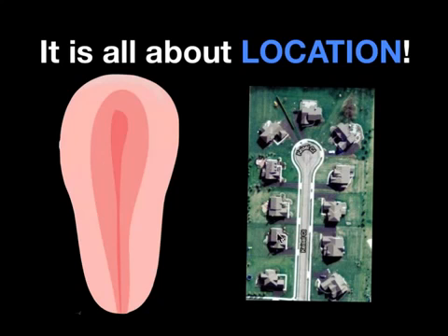And you can see here, this is where the homes are built, that there's some border between the road here, and there's also going to be a border here, looking at these as being the backyard here, at the endometrial myometrial border. So remember, it's important to assess where the pregnancy is implanted.